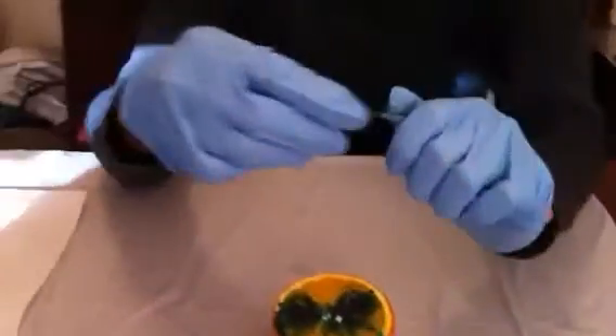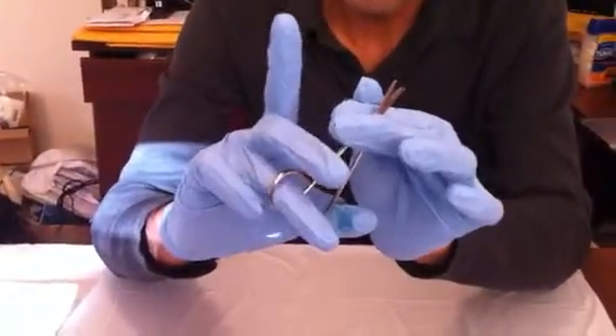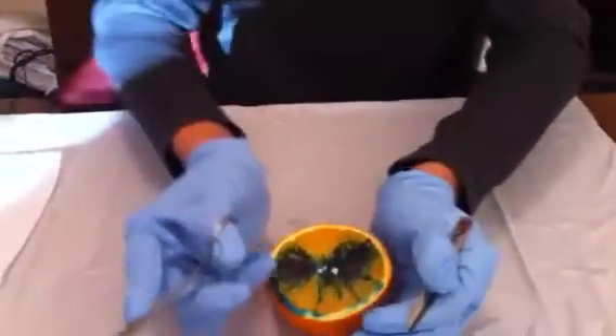We are going to use this first set. This is my hand position here to hold it. I am going to use the scissor in my dominant hand — my thumb and ring finger, supporting it with my middle finger a little bit here. My index finger is on the shaft here to support.